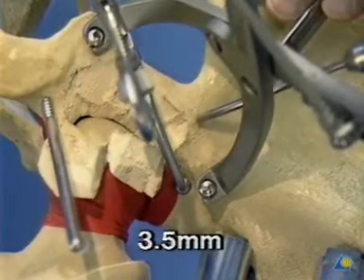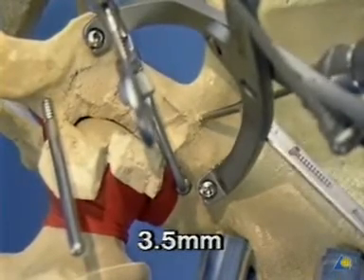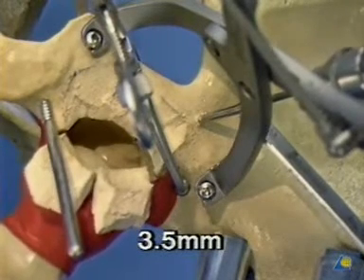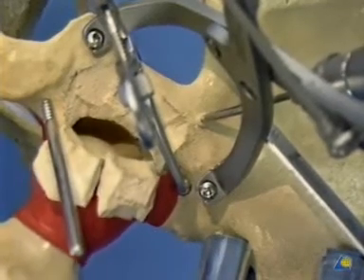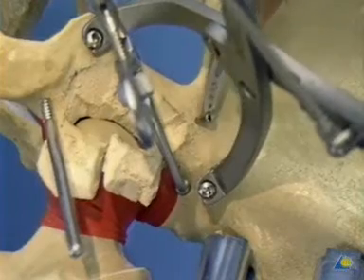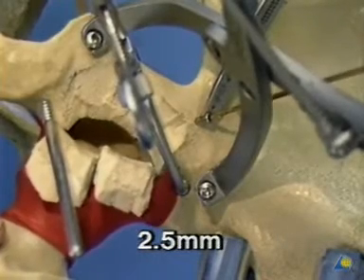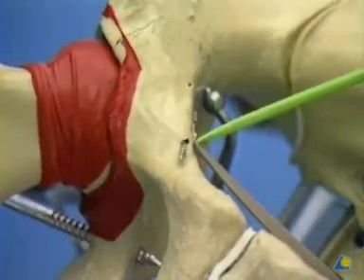The lag screw hole is started with a 3.5 millimeter drill bit at the level of the greater sciatic notch, but lateral to it. The screw is directed towards the superior pubic ramus. The femoral head is distracted during drilling to visualize the joint and avoid joint penetration. The 2.5 millimeter drill bit is used to complete the threaded hole. The drill bit is seen to exit near the pectineal eminence.